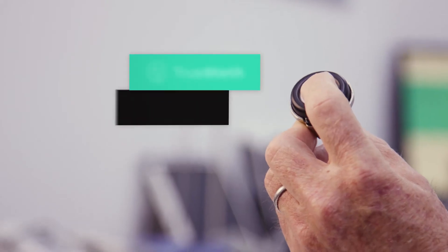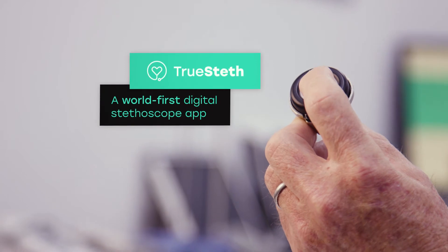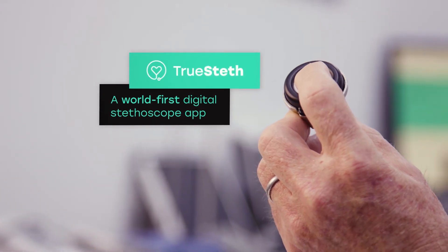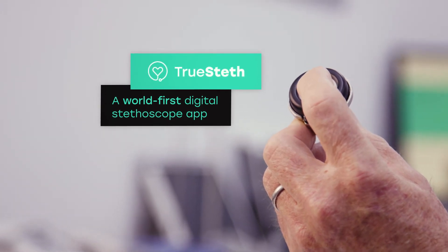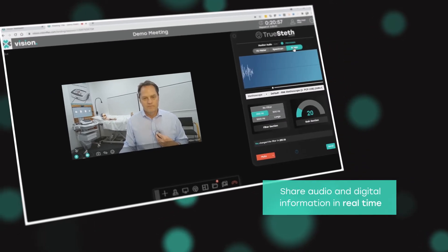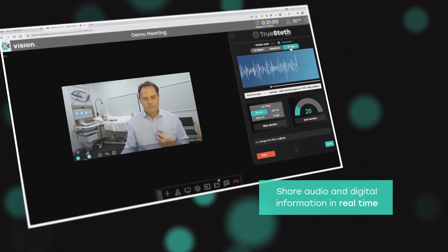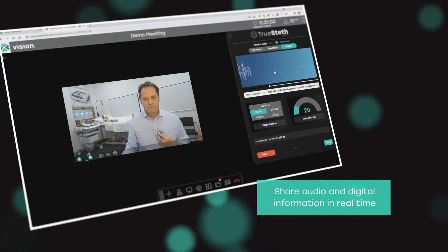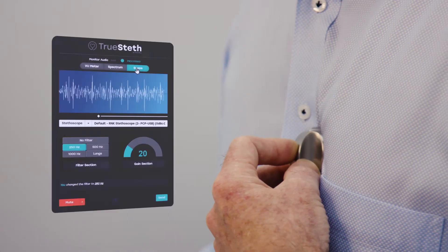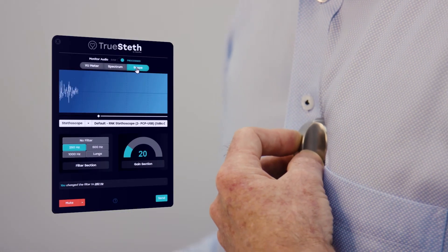The Vision telehealth platform supports a range of clinical consultations. The stethoscope feature has been designed to give the consulting physician control of the stethoscope during the examination so that the local health professional can focus on the patient. The information from the stethoscope is transmitted digitally to everyone in the call and reconstructed into an audio signal for each participant, so the reproduction of the sound is perfect.